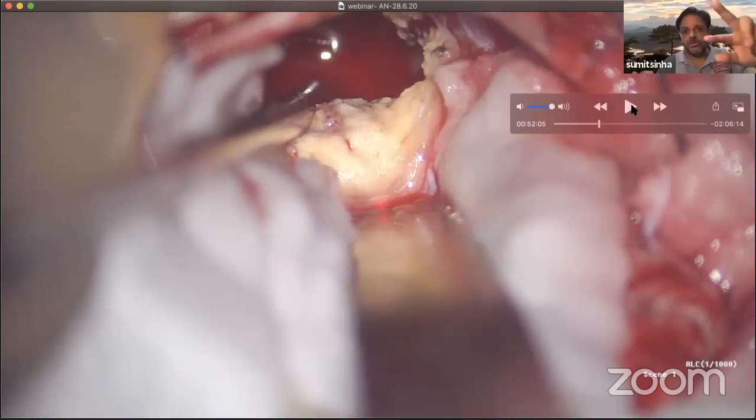So it is these two points where the facial nerve is in the most constant location. If I want to preserve the facial nerve, I have to locate it at these two points first of all. Between these two constant points, the location of the facial nerve is very variable, as it is being pushed by the tumor. So I identify it at these two points, and then I keep on dissecting in between, separating the tumor away from the facial nerve.